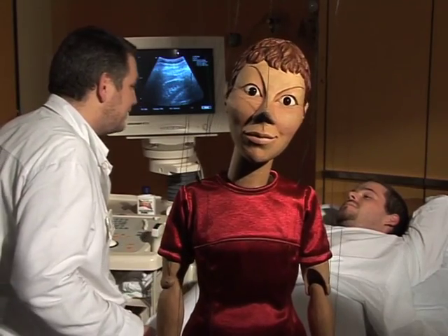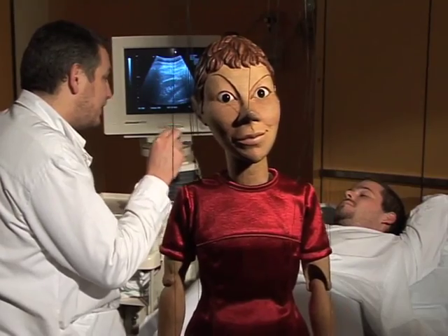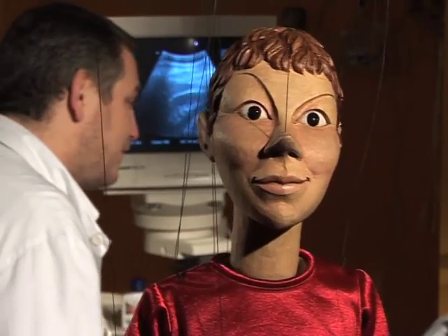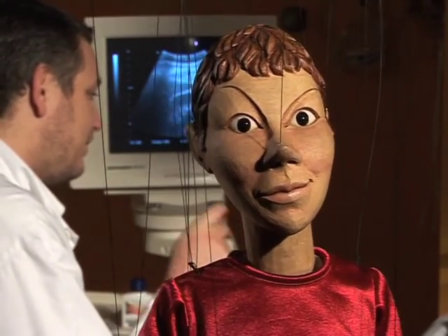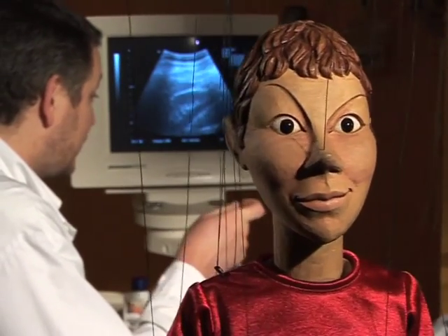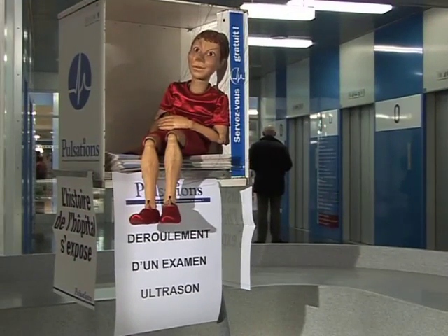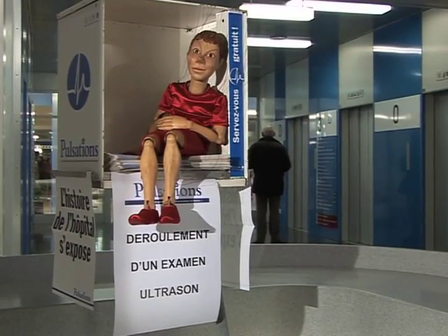As you've noticed, the scan doesn't last very long. It generally takes from 15 to 30 minutes. We have just shown you an abdominal scan. We could also have shown you a scan on another part of the body, the knee or the shoulder, for example. As with most examinations, this is normally paid for by your insurance.